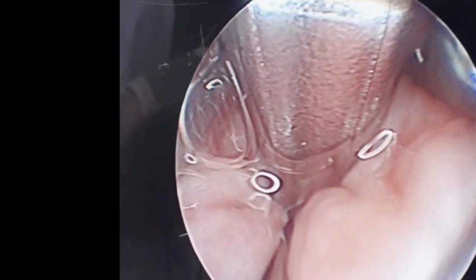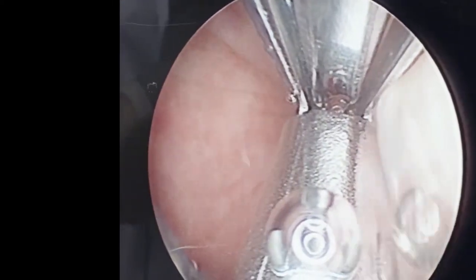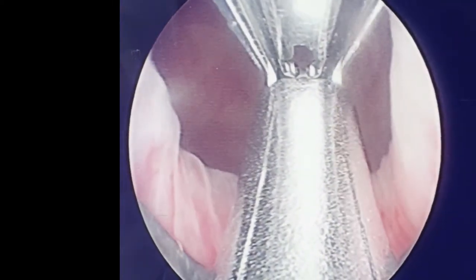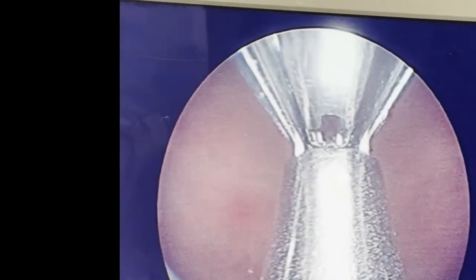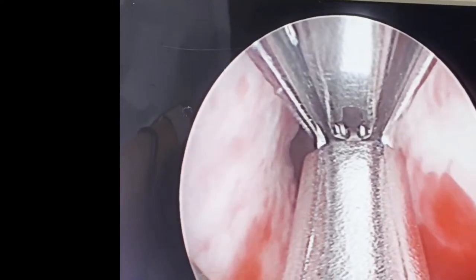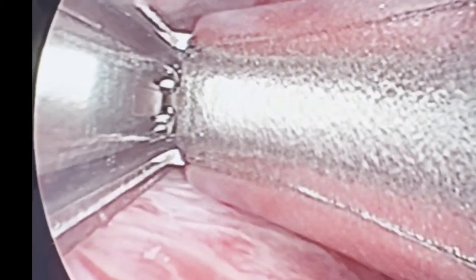Here's actually what our system looks like. The scope is inside the patient right now, and you're looking all the way through into the bladder. The first thing we do is fill up his bladder with some water to try to get it out of the way. All done under that previous anesthetic we talked about. Now we're coming out of the bladder and into the prostate. The key is right there — you want to find the areas of the prostate that you can tuck back, and you don't want to be too close to the bladder neck. You can see him getting lined up, putting it on one side, and you're going to hear that click as it fires in. There it is — it just fired that in. The next noise will be the click as it releases the clip in the back, and now you can see the string right through there.